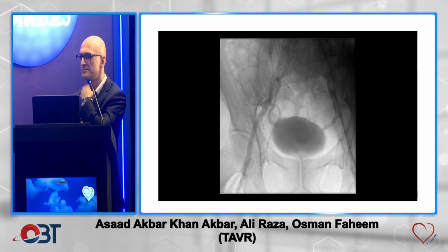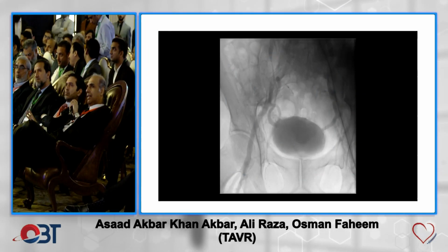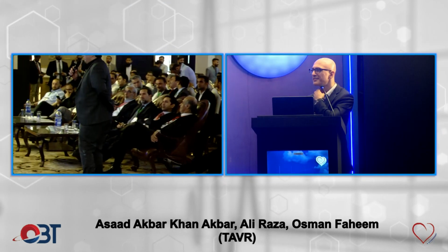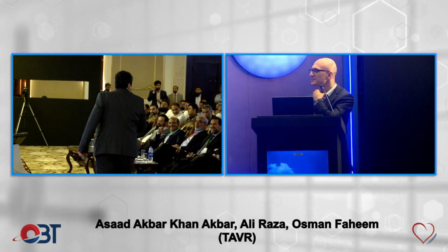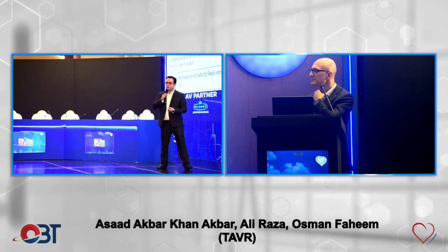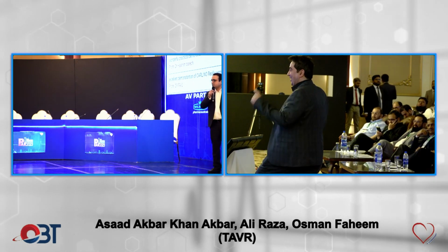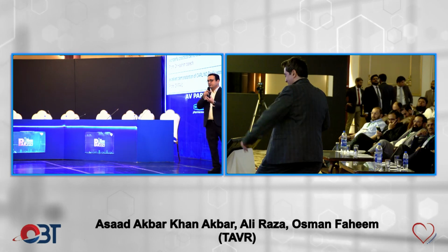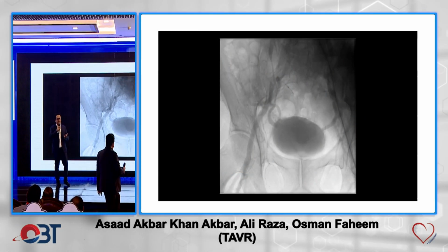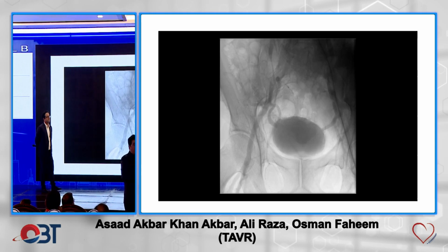If they have this AR, are you more prone to infective endocarditis after that? That's the next part that comes after it. I will let Asad answer this question. I don't know of any of that data because what you are referring to is patients with AR who are more prone to infective endocarditis because of defective leaflets. So here the problem is not defective leaflets, it's the frame is a bit either infolded or whatever the anatomy is. So I don't think there will be a high likelihood. I don't know if anybody else knows anything. But then again, you're very right, it's an important matter related to mortality.